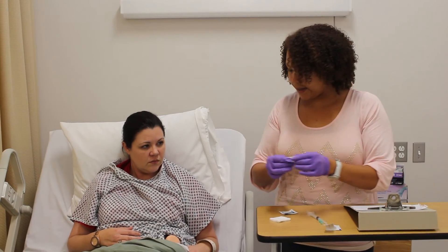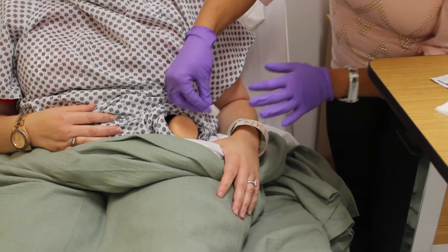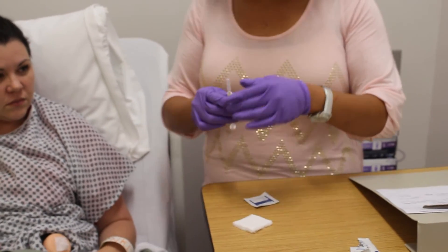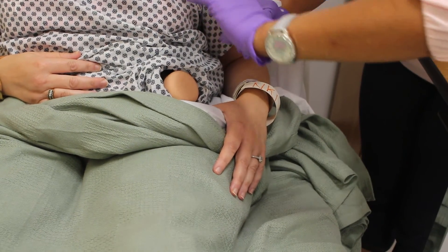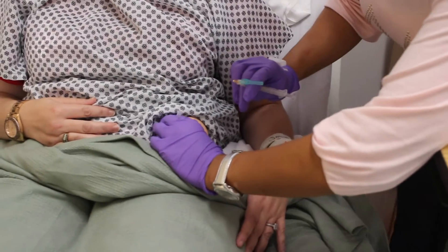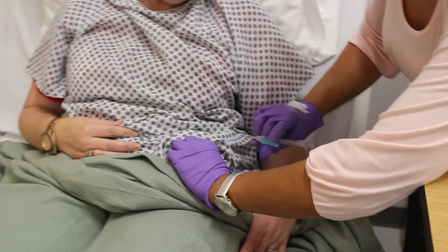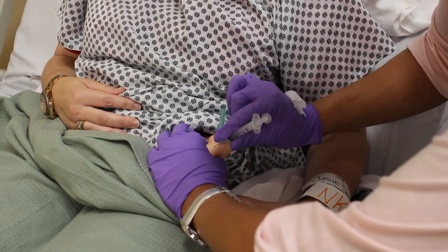I'll clean my site from the inside out, then flip my alcohol pad over the cleaned site so I remember where to go. I'll take my syringe and remove the cap. I'll pinch up about two inches of tissue. If it's less than two inches, I'd go in at a 45 degree angle; since I'm pinching more than two inches, I'll go in at a 90 degree angle. On the count of three, you'll feel a little stick — one, two, three.